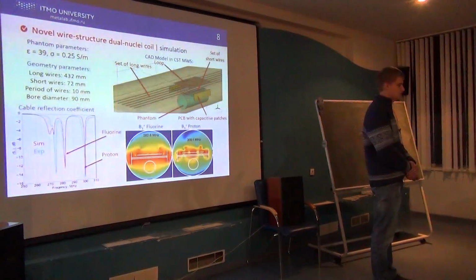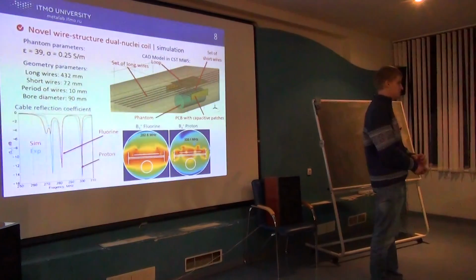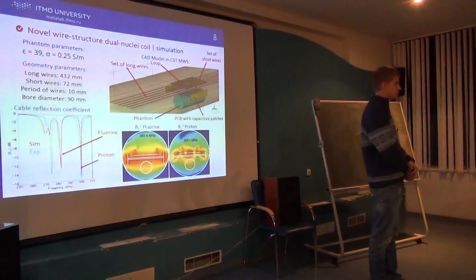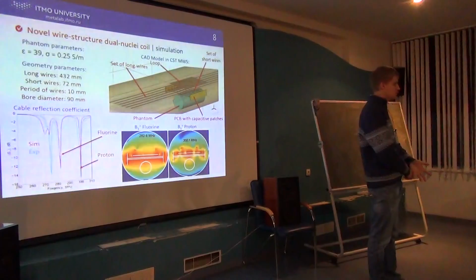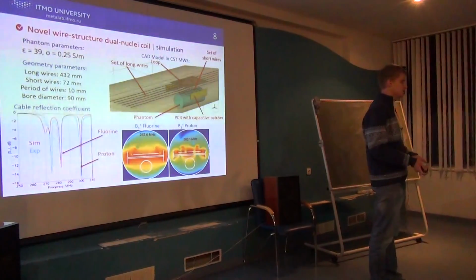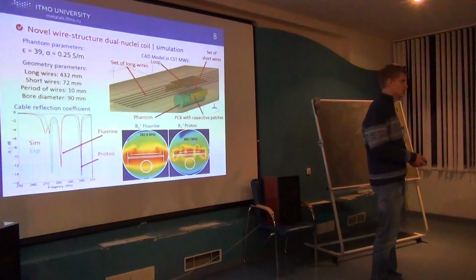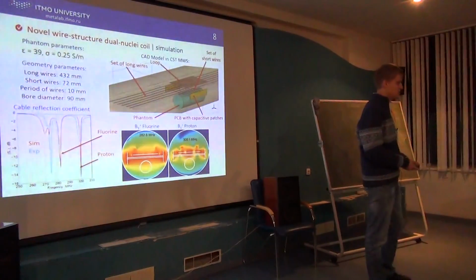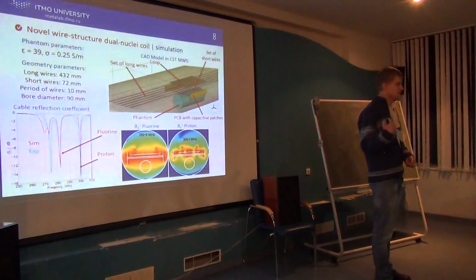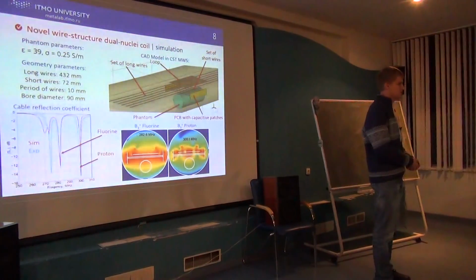So this was done at 7 Tesla with frequencies close to 300 megahertz. And the tunnel was really small. It was 9 centimeters only. In principle, the same antenna can be used for body imaging for humans, for example, at 7 Tesla with a large bore. So the size of the bore doesn't matter for the principle of this antenna. You can still use it. And concerning even higher frequencies, for example, 9 Tesla or more, it's also possible to do. Here there was a problem that these wires should be very small. If the frequency is higher, then this is not a problem already. So it is even easier to use this principle at higher frequencies. So I think it's possible.